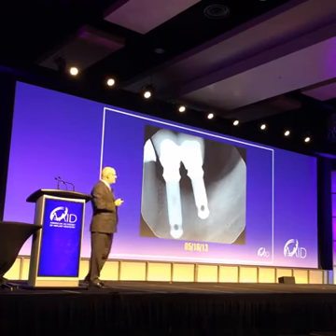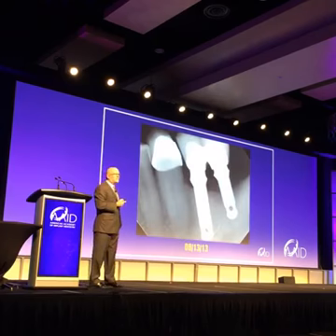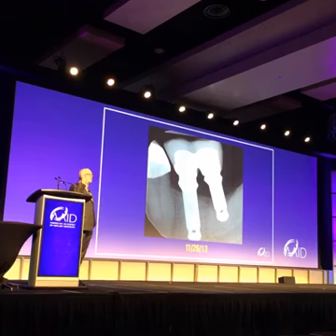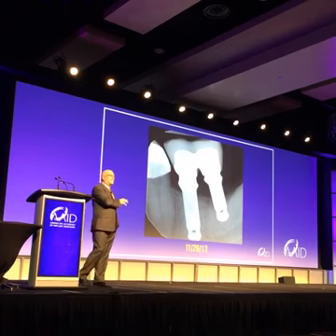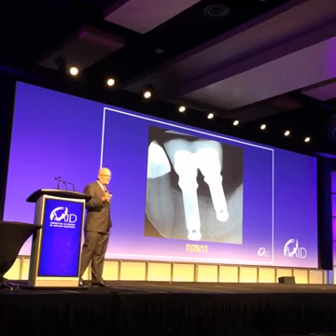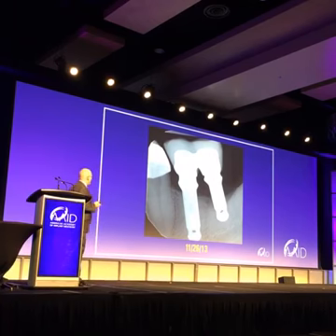This is 3 months, this is 6 months after treatment. There's 9 months after treatment. And there's a year after treatment. Did I get bone to come all the way to the top? Never going to happen. But I got bone to fill in, I got the inflammation down, I gave the implant a second chance. And that's what we're looking for. Give patients a second chance on these implants.